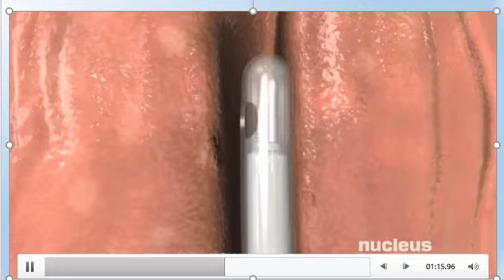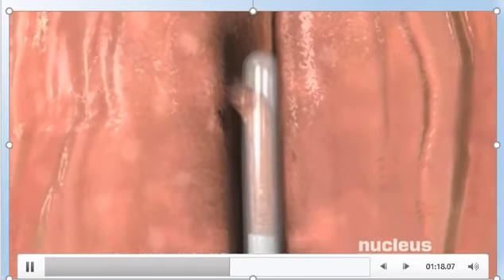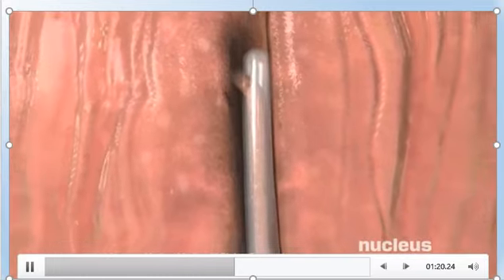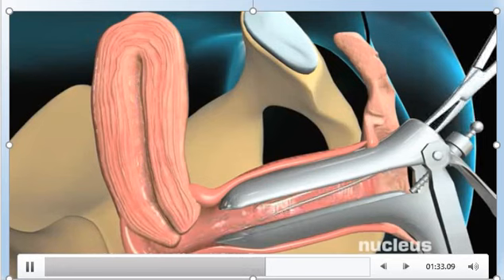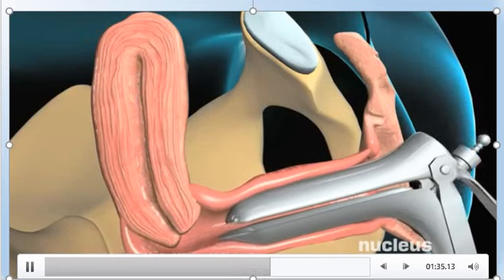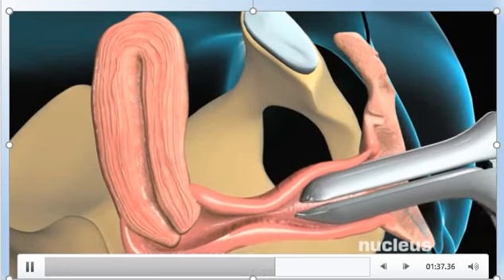Your doctor will then pass a long, thin, flexible tube called a pipelle through your vagina and cervix and into your uterus. The pipelle is equipped with a piston-like device that creates suction when pulled. Your doctor will spin the pipelle and move it up and down in the uterus while suctioning up an adequate sample of endometrial tissue. Then remove the pipelle and place its contents in a container. Your doctor will complete the procedure by removing the tenaculum and speculum.